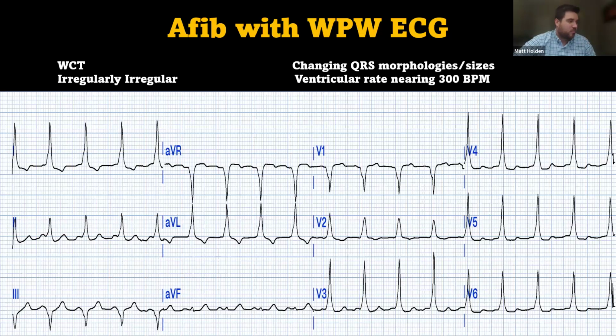AV blockers, yes. Beta blockers, yeah. Anything that's going to essentially, so you got to think AFib is essentially 400 to 600 impulses in your atria, right? And the power of the AV node is like a gatekeeper. It squashes a lot of those signals, and so it only gets you 300 beats per minute at times. So it's squashing out about half to three-quarters of all the impulses, right?